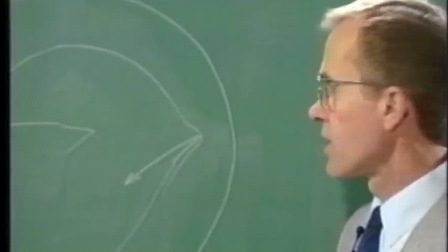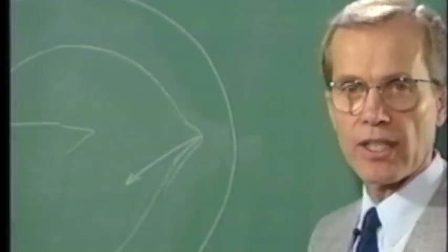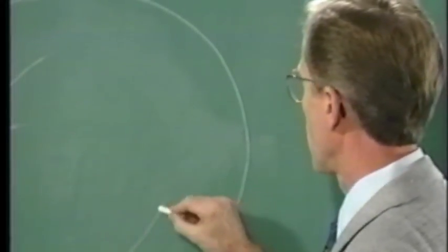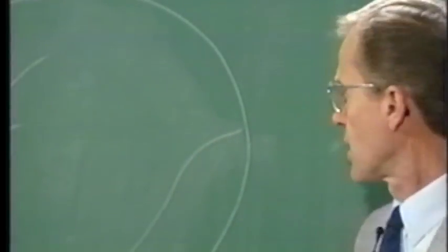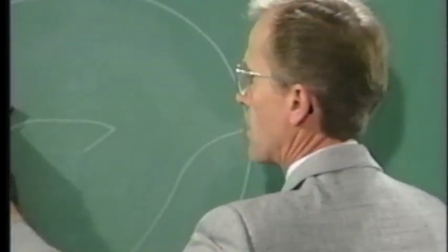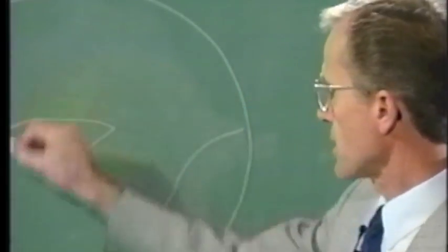Now let's talk about what to do if this tear gets away from you and you have not been able to rescue it. So here we have a tear that has gone out to the equator. We still have to complete the circle.